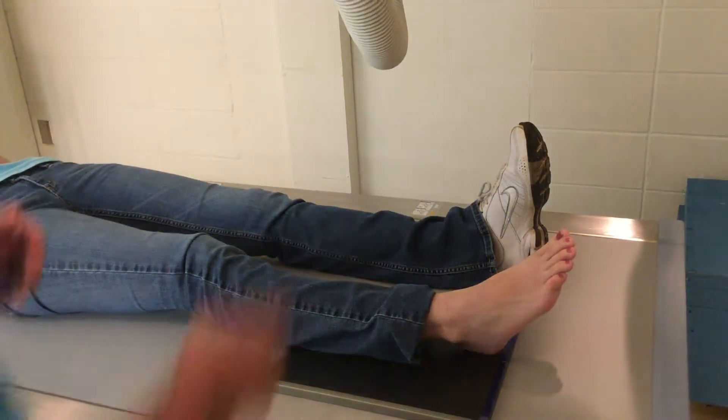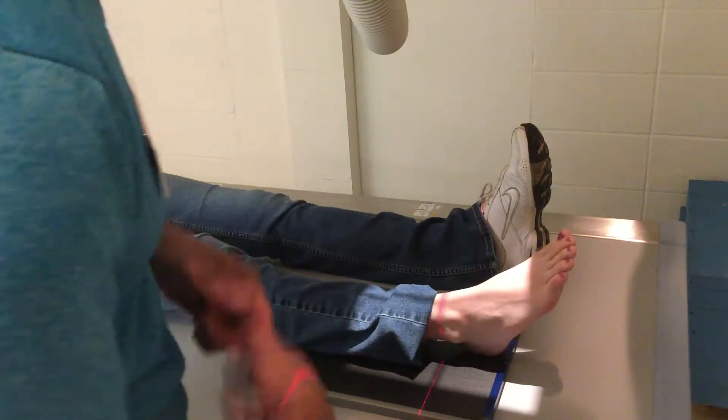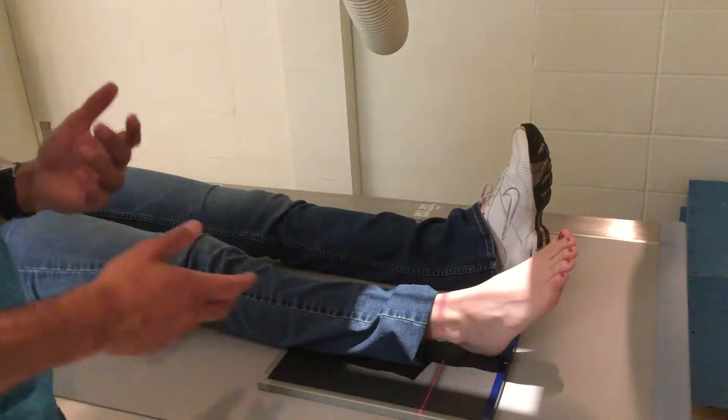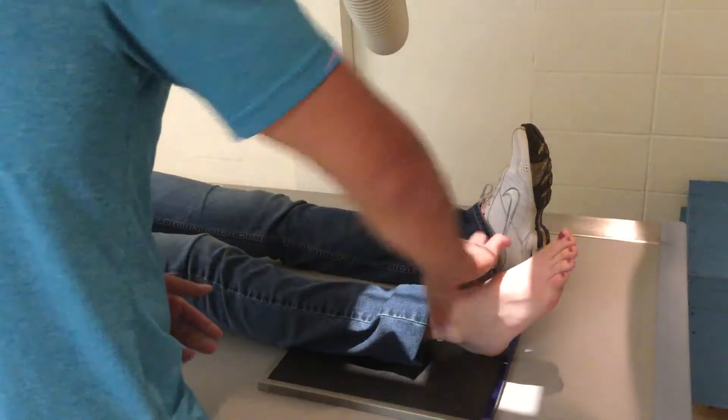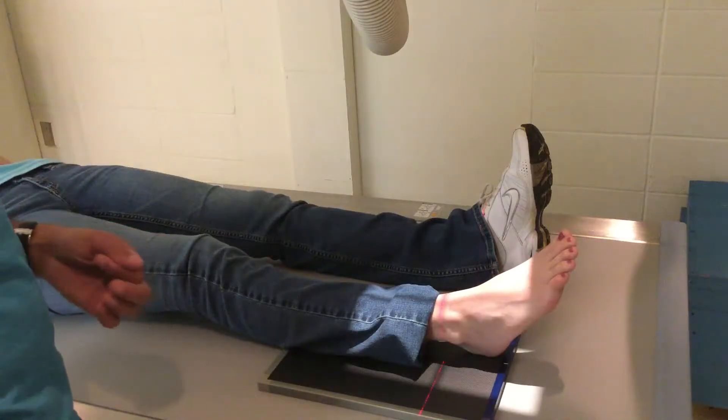Now we're going to move on to the ankle. Very similar to the foot, except this time the leg is flat instead of the plantar surface of the foot. For an ankle, you essentially just need the ankle joint — a little above, a little bit below. I like to include the heel on mine.